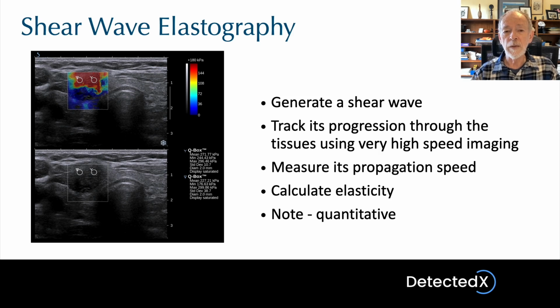An example of applications of this technology is in tracking liver disease. So fibrous degeneration of the liver, fatty degeneration of the liver, cirrhosis, and so on. So shear wave elastography has become a very valuable quantitative tool, providing quite different tissue properties than standard ultrasound imaging.